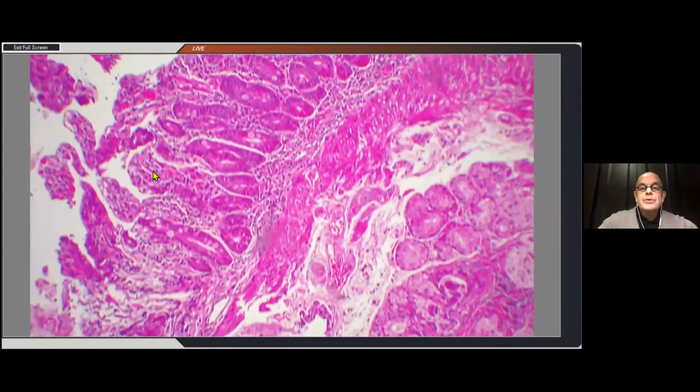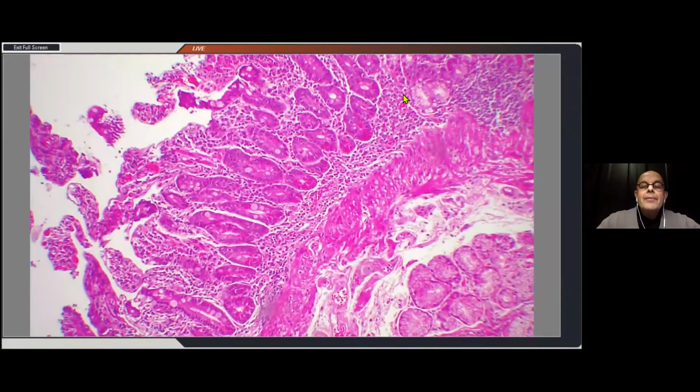Question to Bob, what was the reason for doing a chromogranin A? Well, you were looking for a neuroendocrine tumor, most likely, which was normal, by the way. It was normal, yes. All right, so that didn't help with the diagnosis, so you'll keep looking.